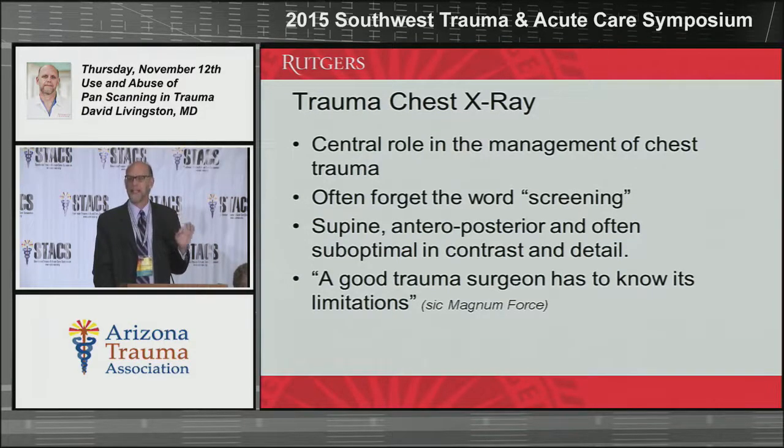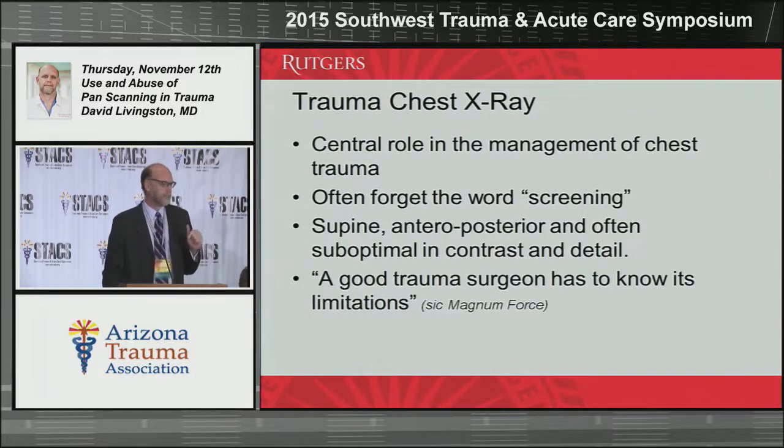And yeah, maybe the EFAST can do this now. Again, I'm a bad sonographer. I will admit it publicly and on webcast. And I will simply say that maybe that will replace this, maybe not. I don't know. But again, it's supine. It's suboptimal, although in a PACS you can change the contrast and really do a lot of things. But as long as you know its limitation, when something's on that x-ray, it's darn important, and you need to address this as well.